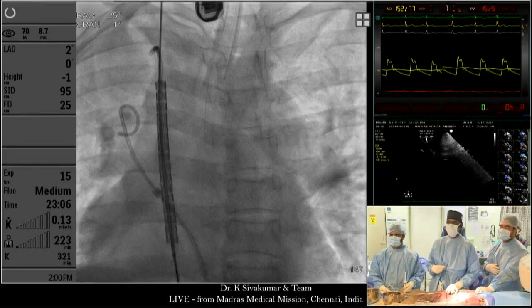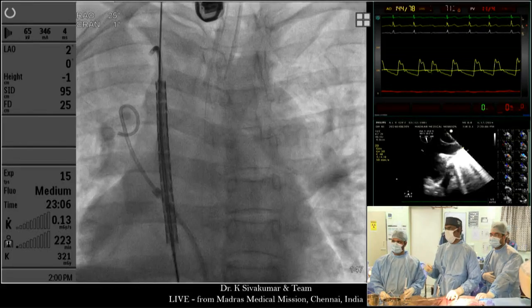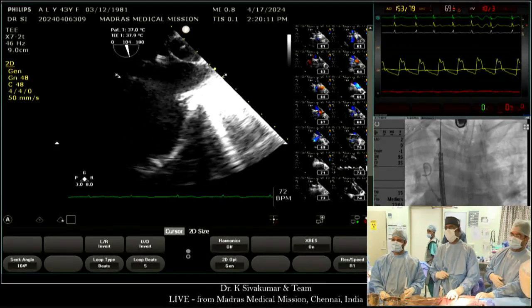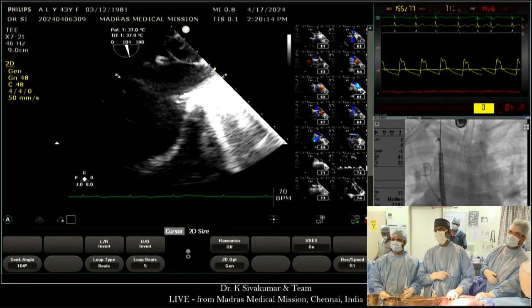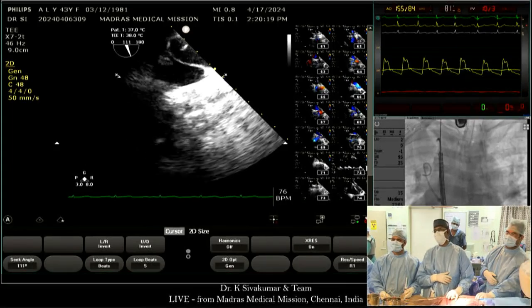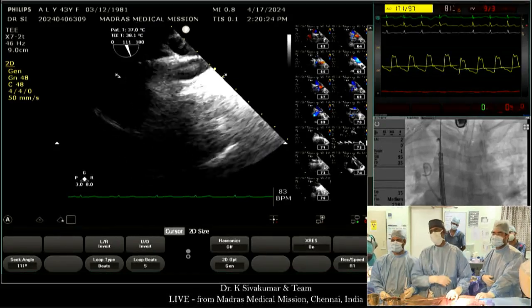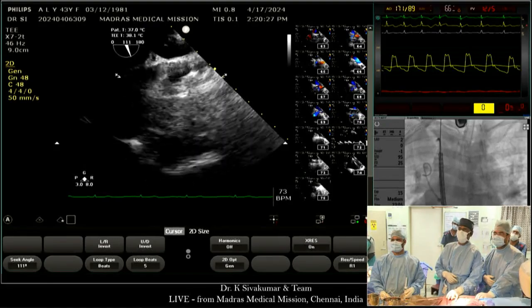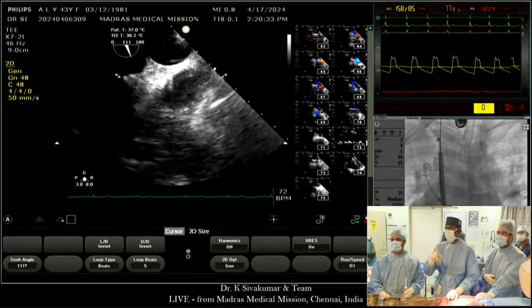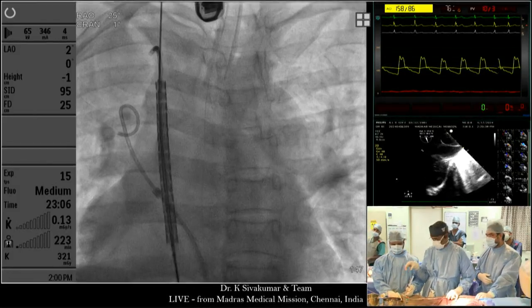Transesophageal, show the caudal end of the stent. Yeah, around 120. Push it inside. Now turn it around and show the caudal end of the stent. Yeah, correct. See, the stent is extending far beyond. Show it a little leftward. Yeah, keep that view with the color Doppler when you inflate. So transesophageal echo on the small screen and this one on the big screen. Good, you will have both.